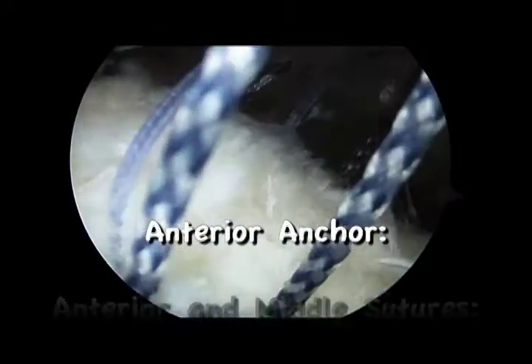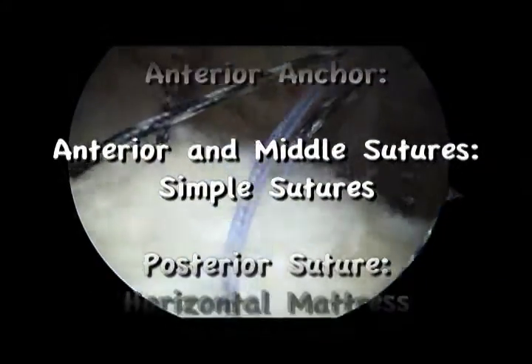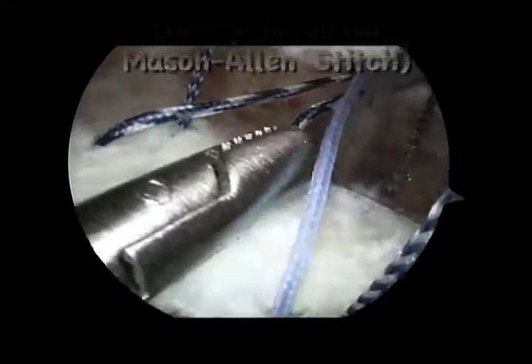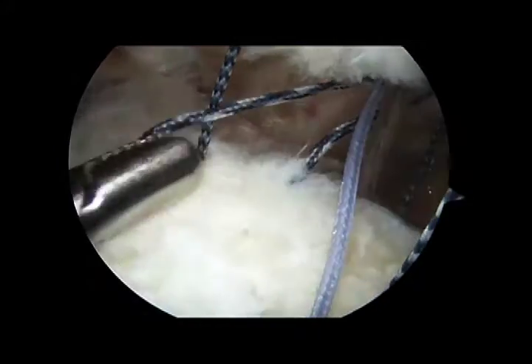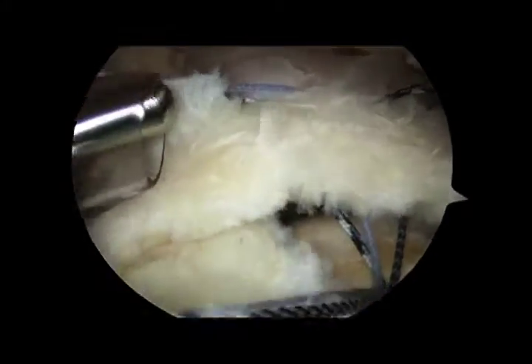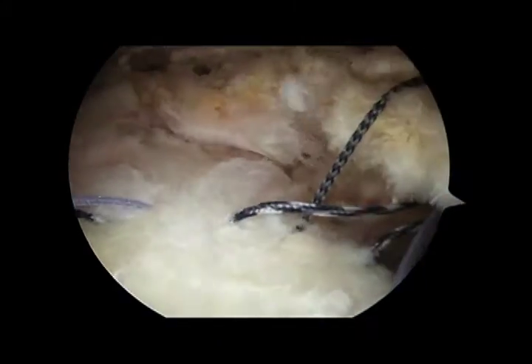With all sutures passed, we can see the anterior and middle sutures from the anterior anchor are passed in a simple fashion, whereas the posterior suture from the anterior anchor is passed as a horizontal mattress, with one limb posterior and one limb anterior to the most anterior suture from the posterior anchor. This results in a modified Mason-Allen stitch linking the two anchors together, as well as a ripstop stitch.